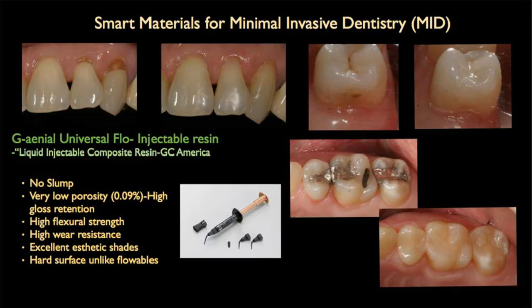One of the interesting things about this material is its hard surface-like feel. I dare to say the word ceramic, but it feels very hard, and it's hard to cut and hard to trim using even a carbide burr. So I now use a diamond burr to get it down and sculpt with. That's how hard that surface can be.